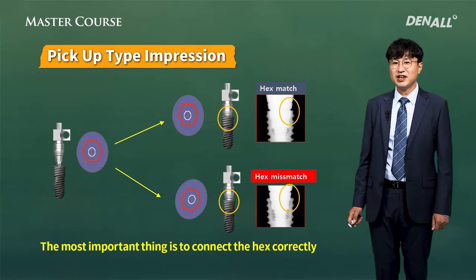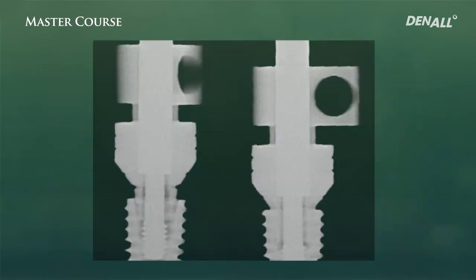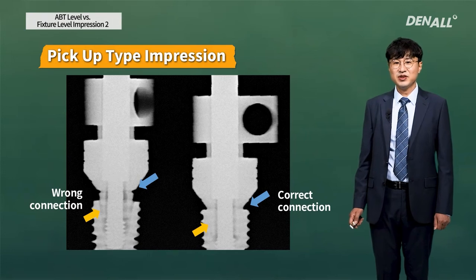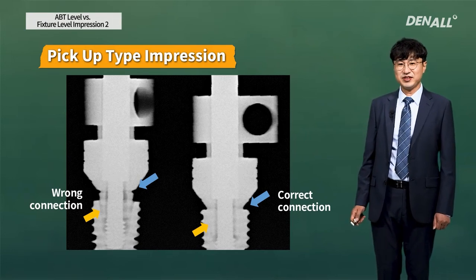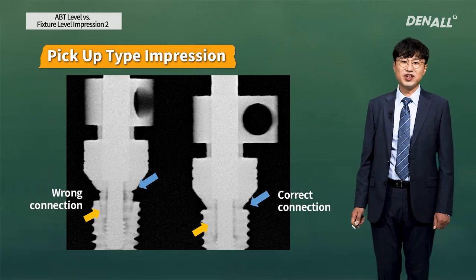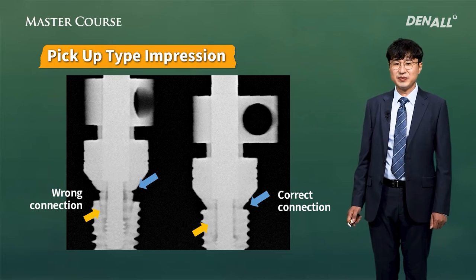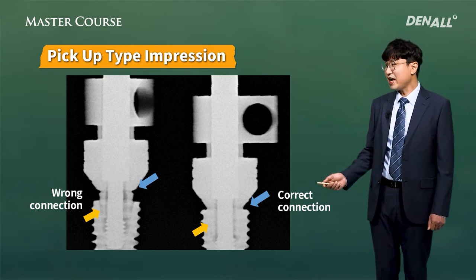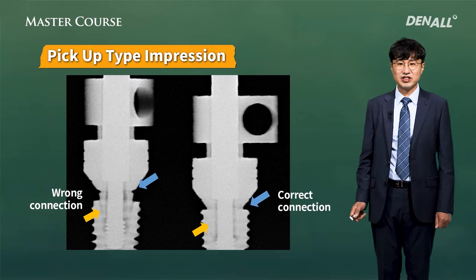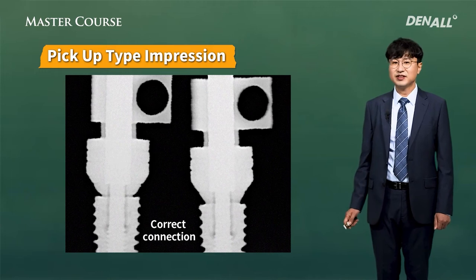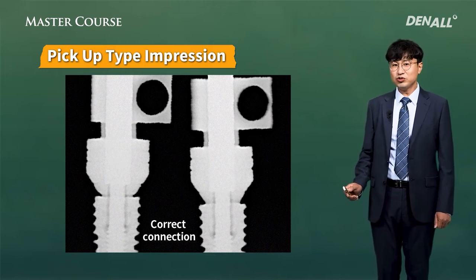The key part is correctly connecting the hex. One connection here is wrong — let's try to find out which one it is. Can you see it? It's an impression coping. There is a notch, and if there is a notch with some distance, that's a wrong connection. There is also a gap that can be used as an identifier to distinguish between wrong and correct connection. This is the correct connection. Even if the hex is wrongly seated, the screw can still be tightened — so you really have to be careful.